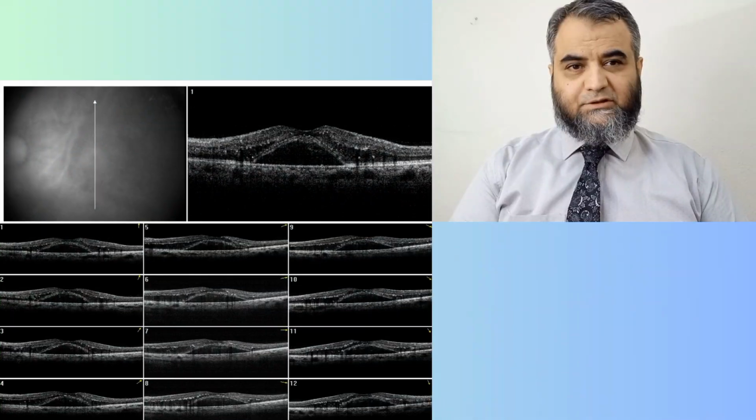This is the OCT of the patient pre-treatment. Before the treatment, this is the OCT. Here you can see extensive subretinal fluid, and even intraretinal fluid, and because of that the patient has macular edema in the left eye.